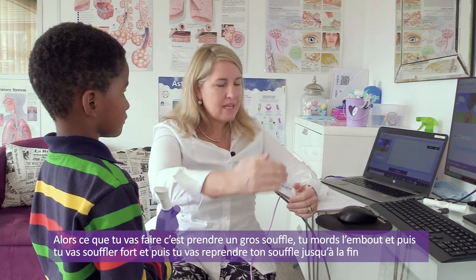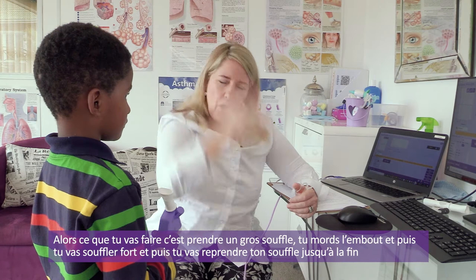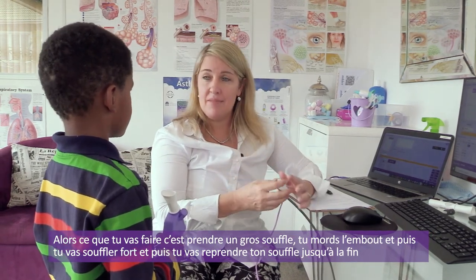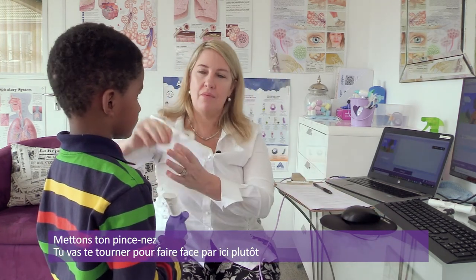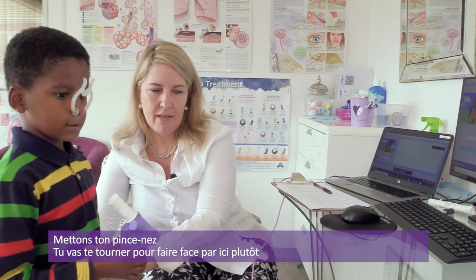So what you're going to do is take a deep breath in, bite your teeth onto the machine, and you're going to blow the air out as fast as you can, and then breathe all the way in again at the end. All right, let's put this nose clip on you, okay? And you're going to turn to face a little bit this way. Okay, and a little bit there. All right, are you ready?